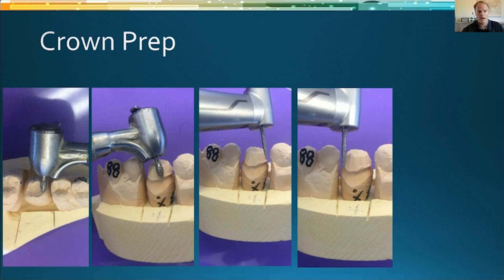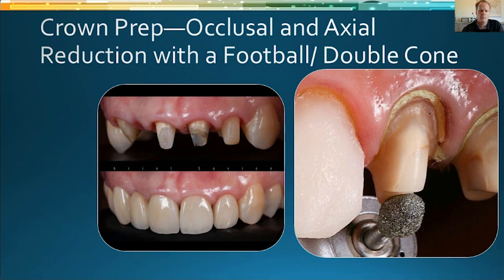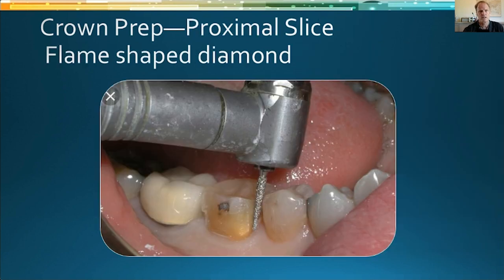So these larger double cone burs are a little larger than the football, a little more radical reduction. They're a little precarious for me. I worry about the end breaking off, and I'll show you one of those cases later on. But I use the football rather than the double cone, even though the double cone is a little more aggressive and efficient. So we'll do our proximal slice with a flame-shaped diamond.